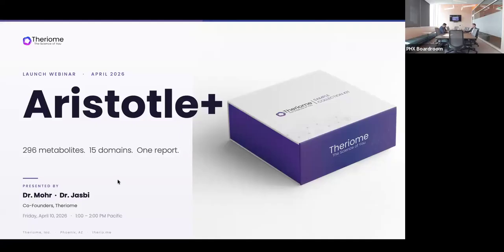We know that you all have full patient schedules, so we're going to try to be respectful of your time and move briskly. Today is the first end-to-end walkthrough of the new Aristotle Plus platform. By the end of the session, you will know exactly how to order it, how to read it, and how to put it to work for your very next patient.